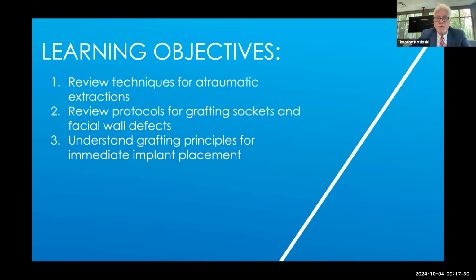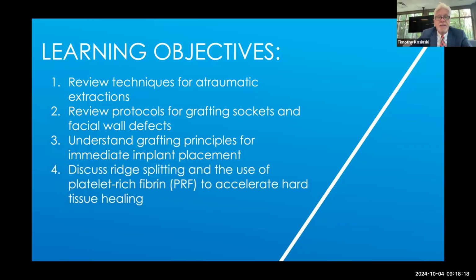Understanding the grafting principles for immediate implant placement. That's important. If we have a site that we anesthetize, we numb the patient, we remove a tooth, we're able to immediately place an implant, which eliminates the additional healing time for grafting to occur, but also allows the patient to go through one surgical procedure as opposed to many. And there's certain rules that we have to follow to implement that.